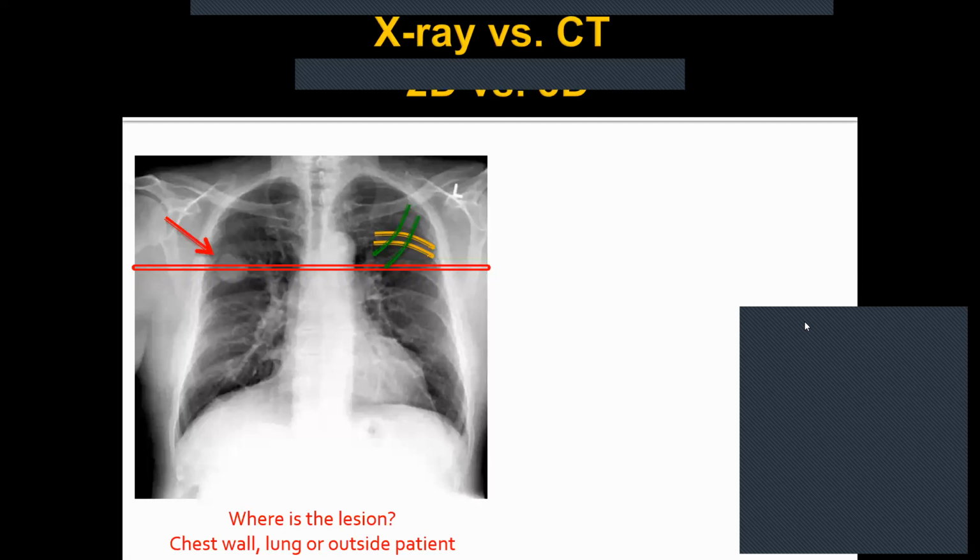Because at the end of the day, you do need rays that pass through the patient to get something on the slide. Right? Otherwise, it's going to stay as a blank sheet. And so as you increase kVp, you get higher energy X-rays, and more X-rays that will hit the image. And so that will produce a higher quality image because the computer will correct for it afterwards. Does that make sense?